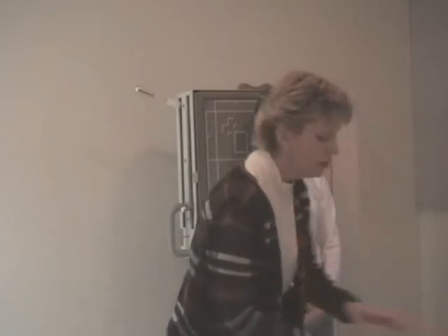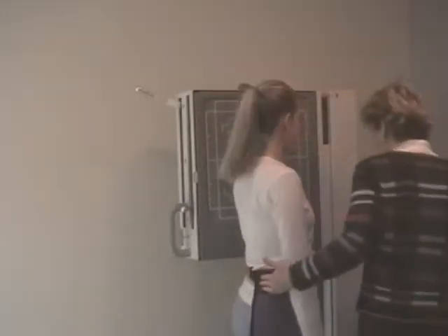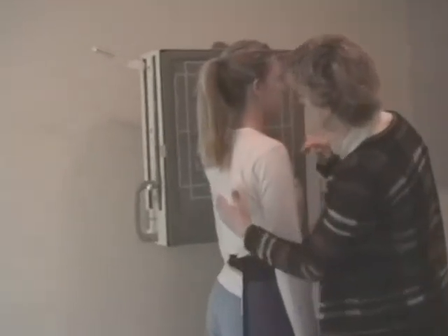But I'm going to show you how to use those just in case you do have a patient with big shoulders or short necks. Because if you don't demonstrate C7, like I said, you will have to do something to get it demonstrated. Okay. So the patient's going to be in a true lateral position, feet are spread. Look at the shoulders and the hips, just like we've done with every other lateral scenario.